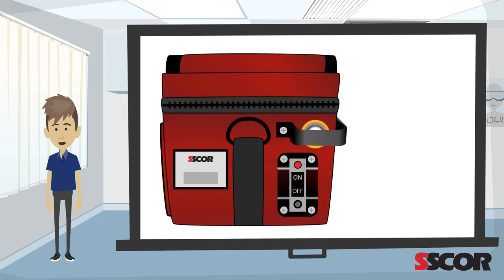The Escort 3 is designed for ease of use: the easy on-off switch, a two position regulator adjustable for adults or pediatrics, and the charging port.